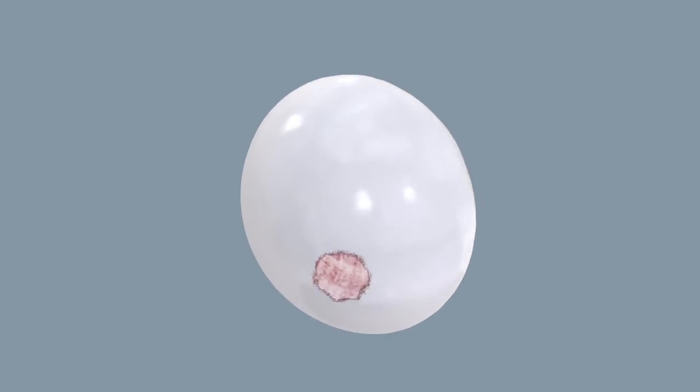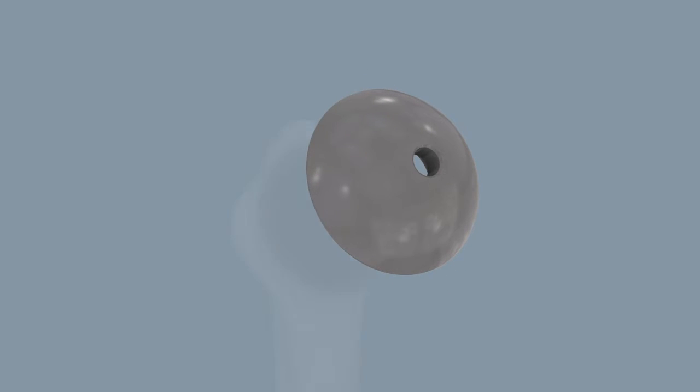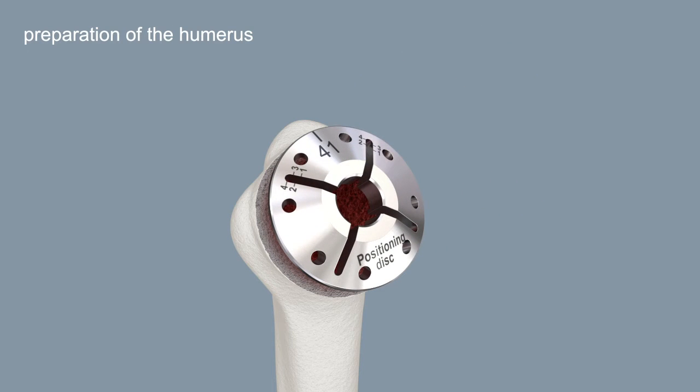Determine the head size based on your pre-operative planning and by size comparison of the resected humeral head with the trial heads. Center the positioning disc on the resection plane, aligned with the outer cortical border.